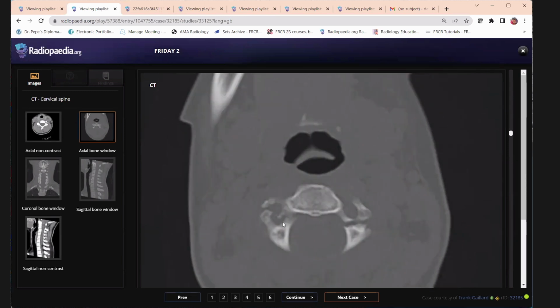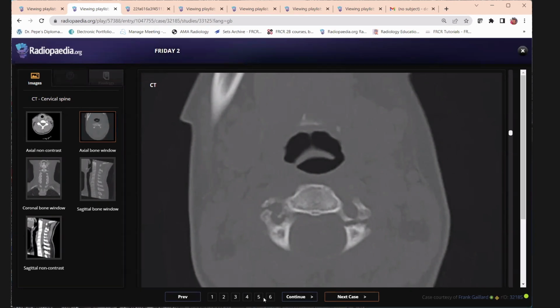And after a foramen transversarium fracture, this patient needed an MRI just to look for the flow void. That was the only reason MRI was done for this case.